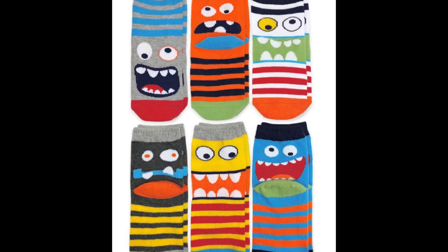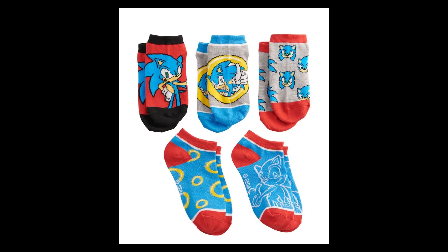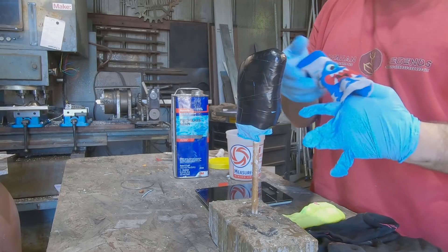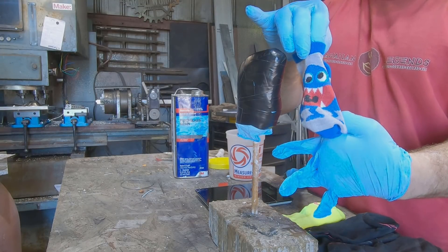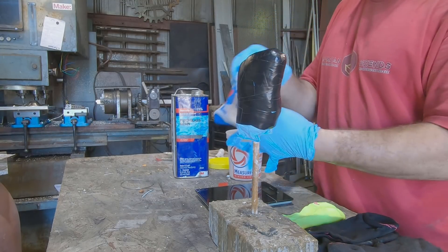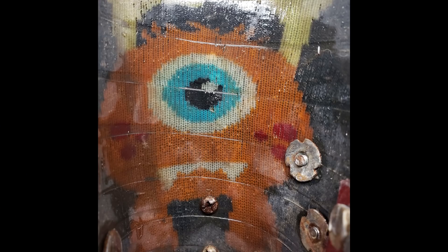First thing we need to do is lay out the reinforcing material. I've had really good luck using kid socks as reinforcing material for the socket. When selecting which socks to use, you want to make sure to use 100% cotton or a 70-30 blend sock, so there's less of a chance of reaction between the resin and the reinforcing material. I find that using five layers of socks makes a socket that's strong enough for most applications.